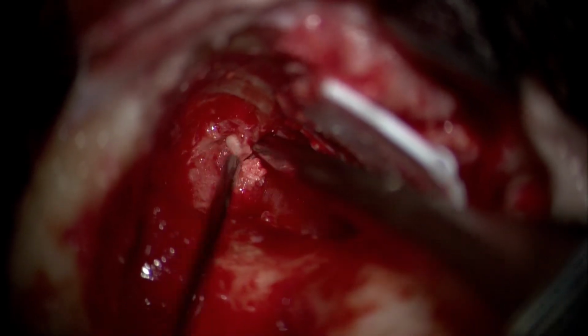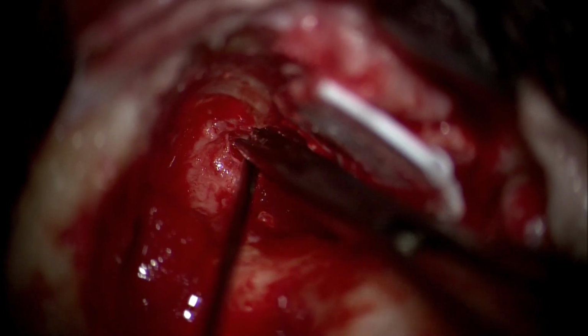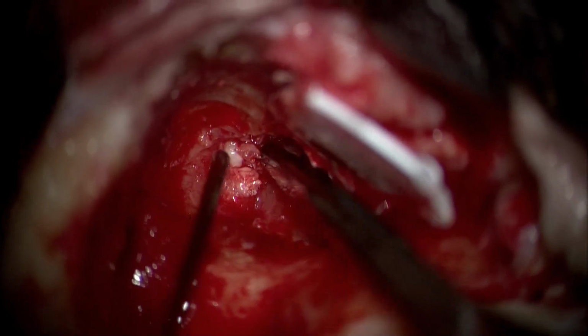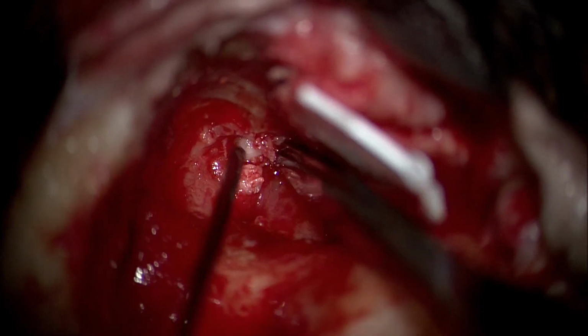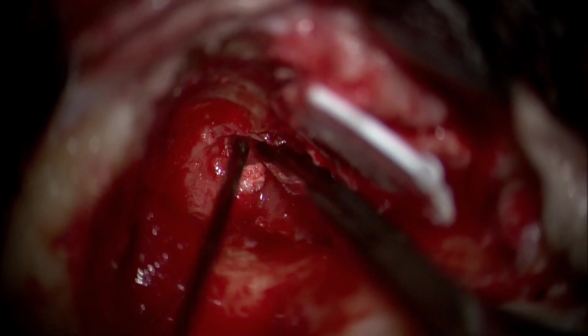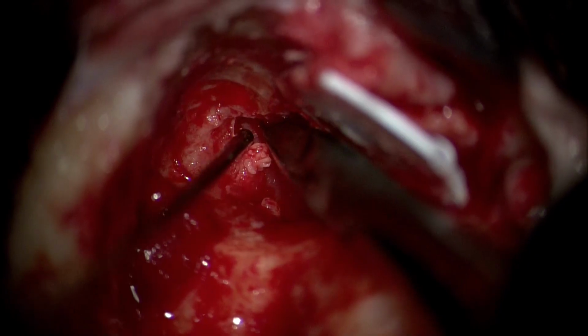And one should appreciate how important it is to broadly open this area, because sometimes there is enough disease clearance from the rest of the area but not clearing the anterior epitympanic recess can lead to grossly missing disease, which would obviously come back with a recurrence. That would be unfortunate. You can see how a small epithelial pearl is lying hidden inside the anterior epitympanic recess, and why it is so important to open this area and, as a process, search for disease here and not just imagine or hope that there's nothing here.